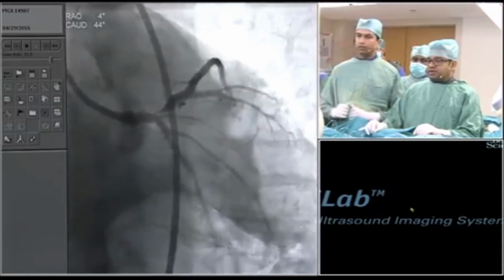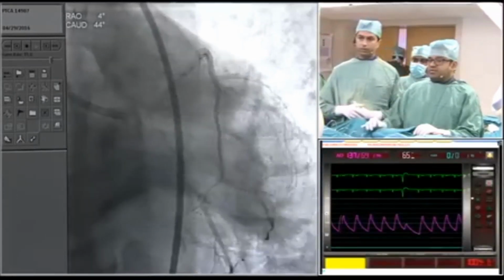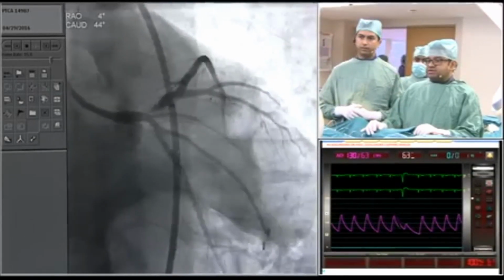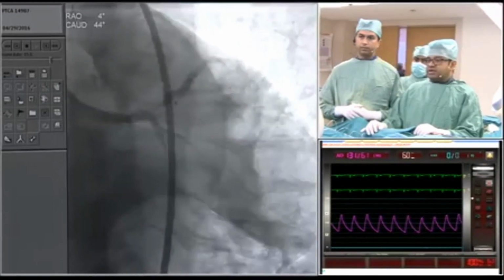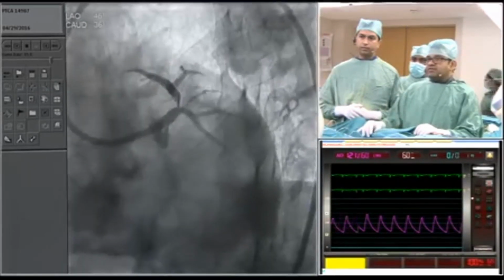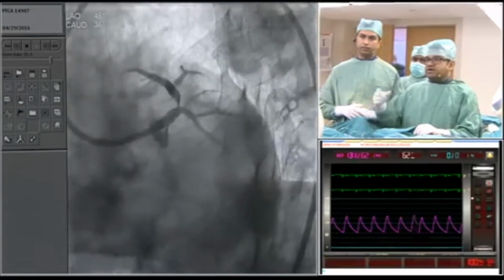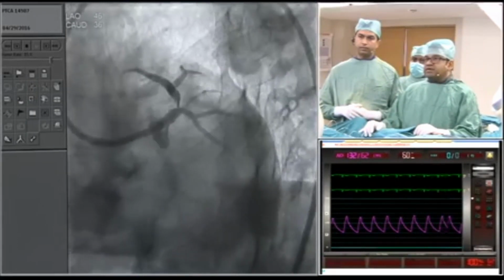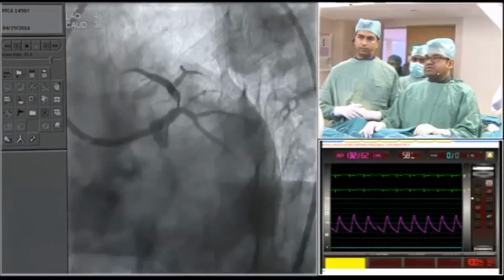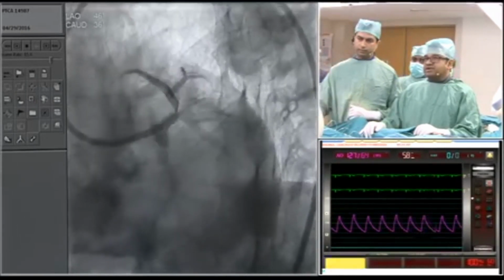We had done a cath yesterday, and he had an almost severely narrowed ostial LAD, and there was significant plaque at the distal left main also, you could see, and then there is a moderate size circumflex. This is the guide catheter we have taken just now before we became live. You could see that is a bang ostial left anterior descending artery. There's a huge type 3 LAD, and no wonder he was having severe rest angina.